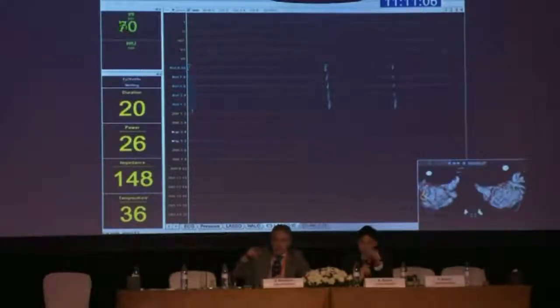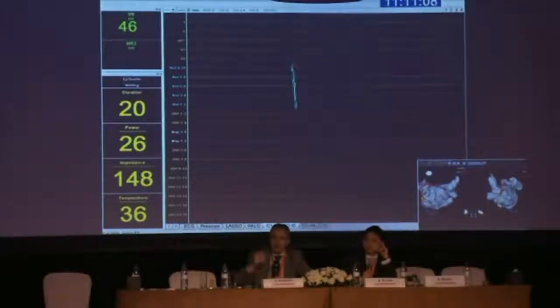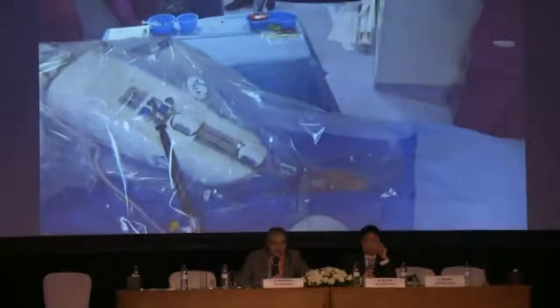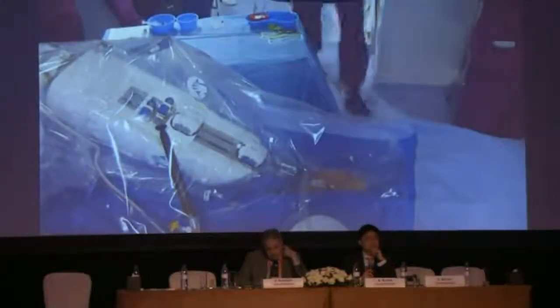There is one question. Hey Richard, thanks. This is Haran speaking. Beautiful case, very impressive. I'm just asking you a question regarding the point that got you back into sinus rhythm. You didn't really map the atrium very much, so how come you chose that point? I can understand that you're looking for rapid firing, but how do you know where the fastest firing point is without really mapping the atrium?